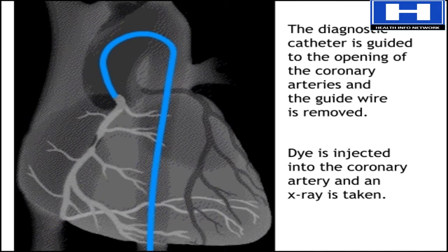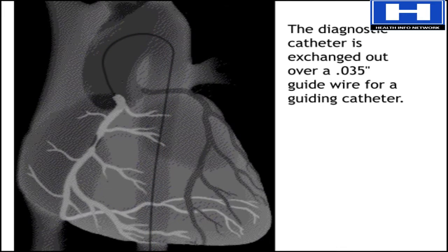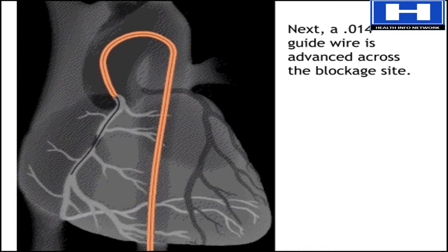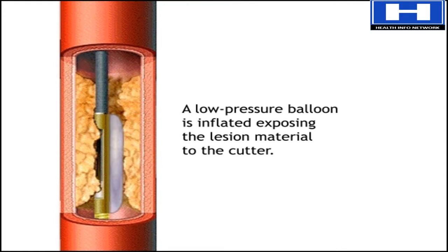If it shows a treatable blockage, the doctor uses another guide wire to remove the first catheter and replace it with a guiding catheter. Then the wire is removed and replaced by a finer wire that is advanced across the blockage. Another catheter, designed for lesion cutting, is also advanced across the blockage site. A low-pressure balloon attached next to the cutter is inflated, exposing lesion material to the cutter.